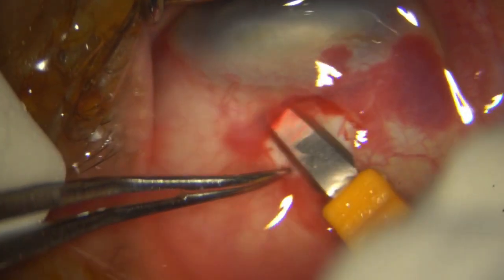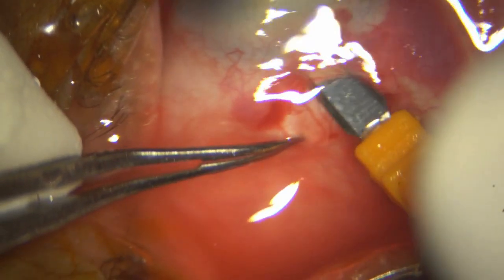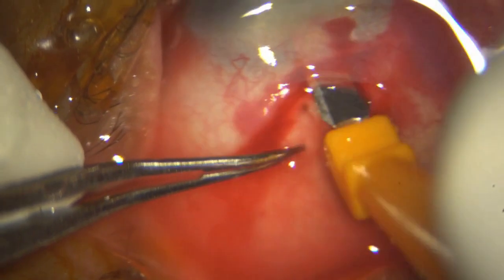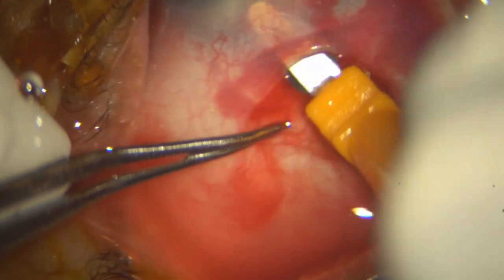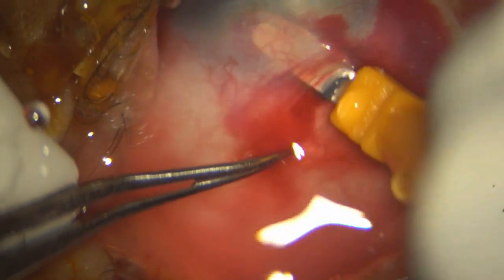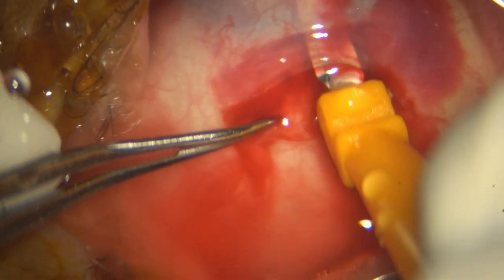So I'm now going ahead and making my corneoscleral tunnel. I've got the plane, looks good, and as you can see, I'm cutting sideways and backwards. Very important in this is don't inadvertently enter into the chamber. In this case, you will be in a lot of pain. So I'm trying my best.